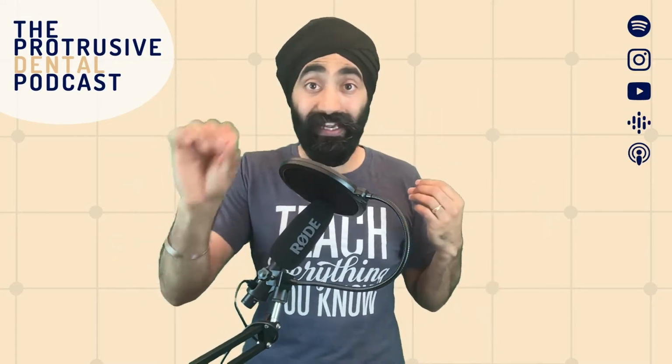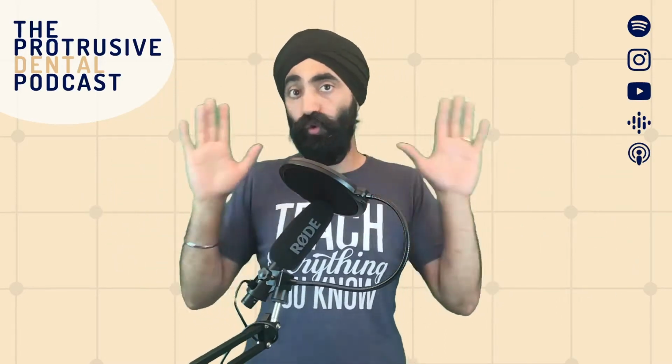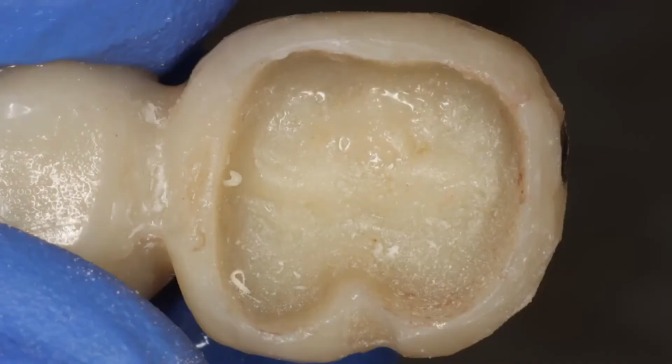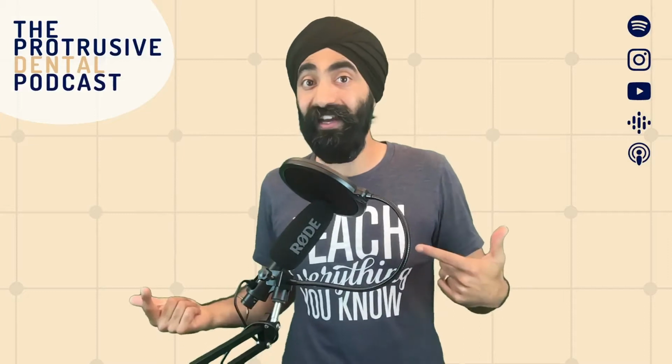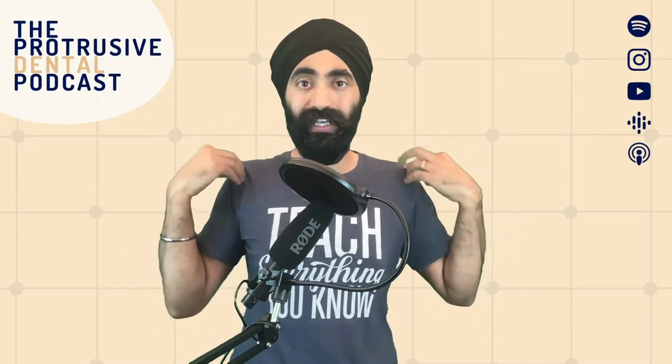Now that I've colored that in, I'm not going to touch that. I'm going to do my soft flexing, diamond burring, acrylic burring, whatever, however you want to polish your temporary, I will do it, but I will not touch that penciled mark. So now you've got a nice trimmed polished temporary, but you've got a contact area that's preserved mesially and distally, which is brilliant, because now you've got a nice tight snug fit that's not overly tight, but it's nice and smooth as well. So this is my big tip passed on from these Italian guys.